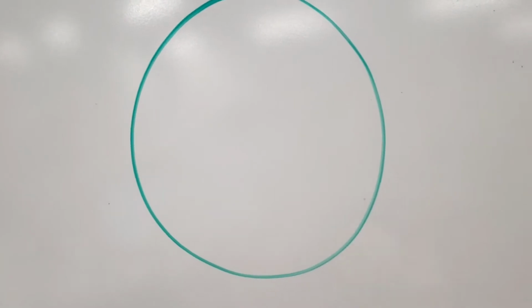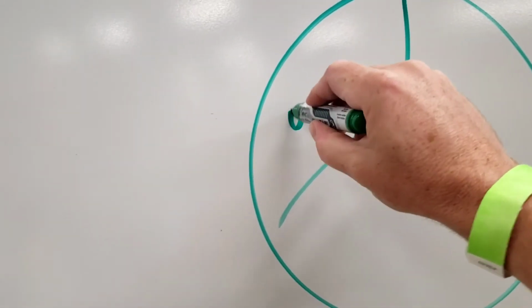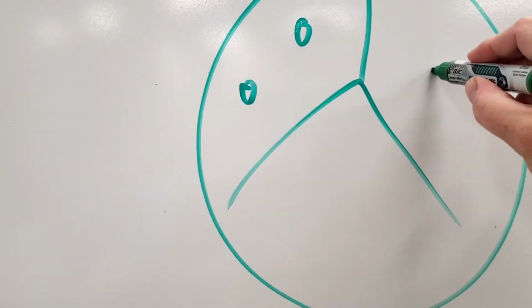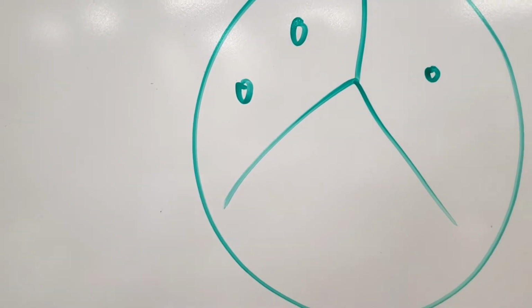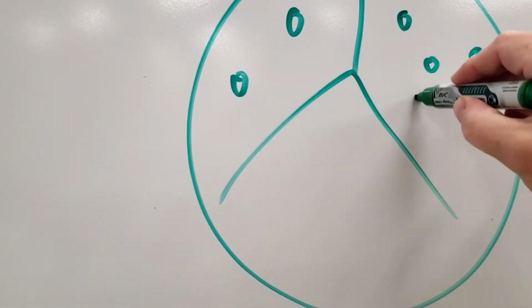So you'll have a Petri dish like that, and the Petri dish is split up into 3 sections. In one of them, you're going to have a red and the blue dye, and then in the other section, you'll have your patient or your sample. So that would be an unknown blood type, and then you'll have the 3 wells around it.